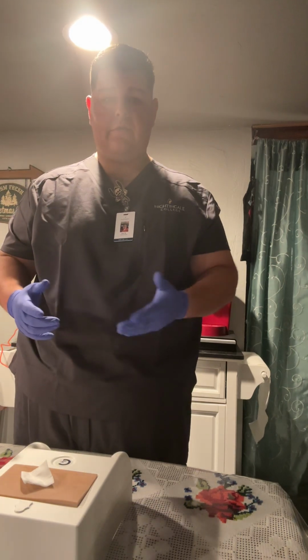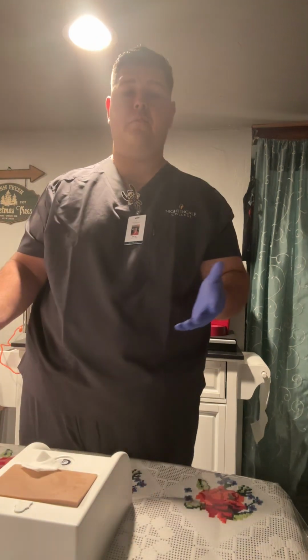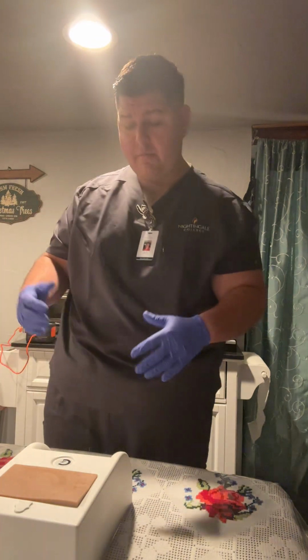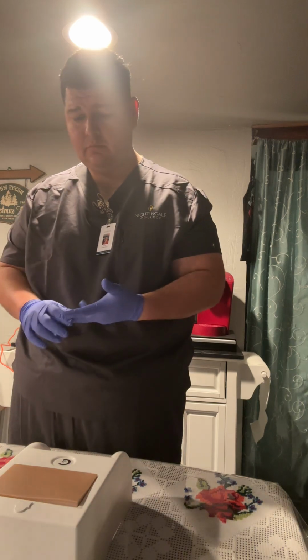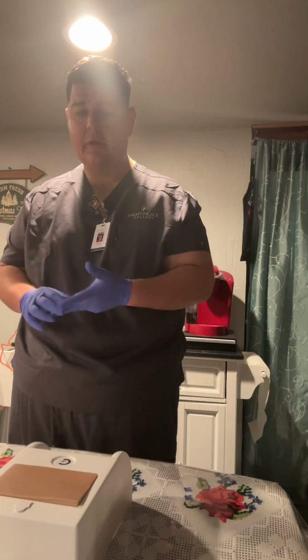In this circumstance, there is no bleeding. You can lift up and don't see anything. So there's no bleeding, so there's no need for a band-aid. Go ahead and remove the gauze. Once I'm done, I can check on my patient. Mr. Miranda, are you okay? Okay, you feeling okay?